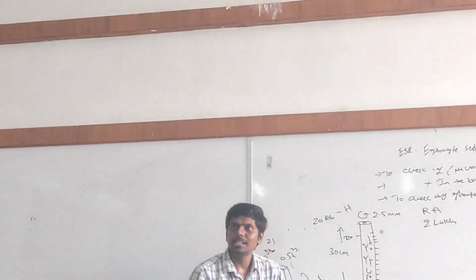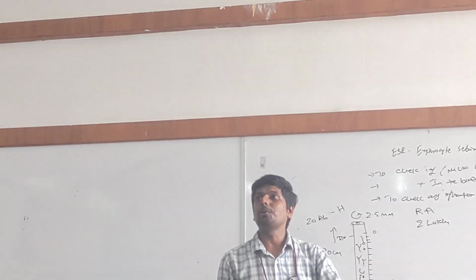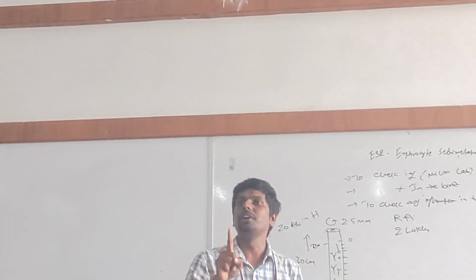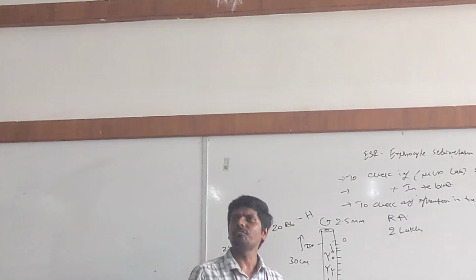But still, it plays a vital role in hematology. The reason is, this is a cheap, easy, less manpower required test. That is the approach in every diagnosis. First, we will do the simple, low cost test. This test will cost around 50 rupees.